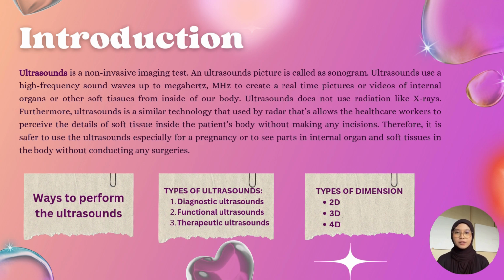The 3D ultrasound has also been used for other medical purposes, such as evaluating uterine polyps and fibroids. The 4D ultrasound is actually a 3D ultrasound in motion, which is a video in 3D. Sonographers rarely use 3D and 4D fetal ultrasound imaging for medical purposes, even though it can be helpful for other medical purposes.